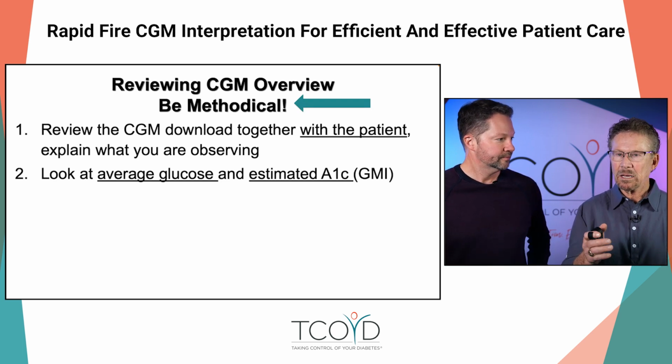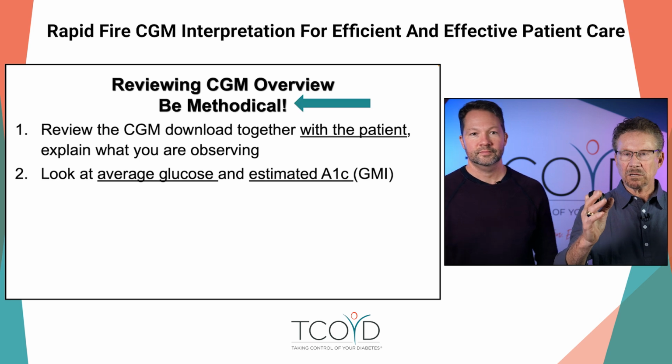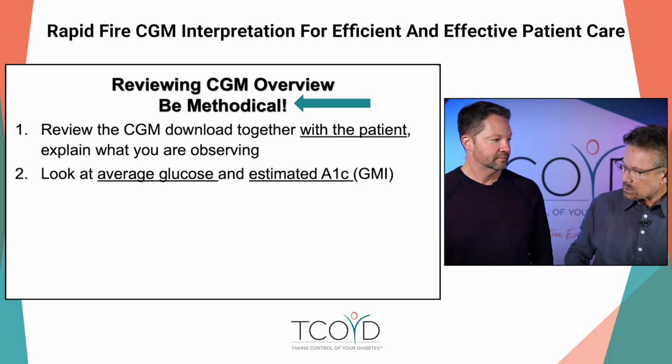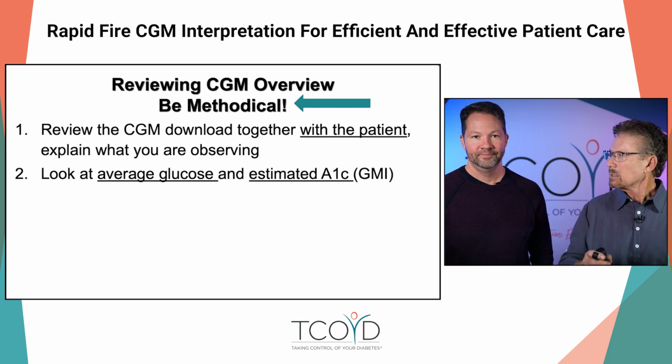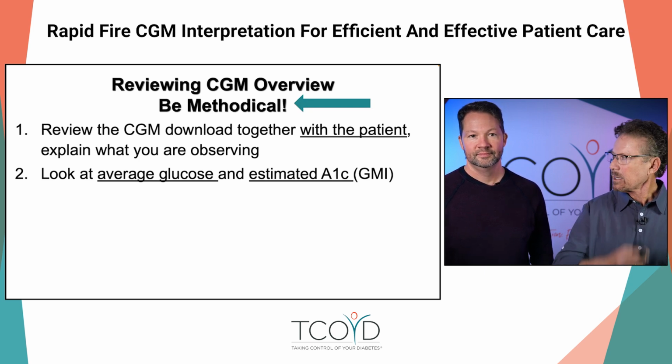It's the same verbiage, and you might be lucky enough to have technology where you have a big screen and the patient sits next to you. Or if you don't have that, you print it up. Yeah. And then you get out your Sharpie and you just mark the heck out of it.